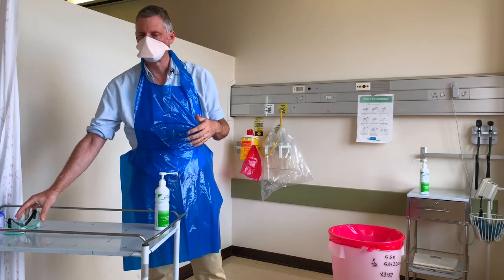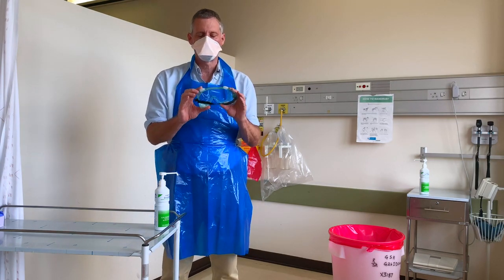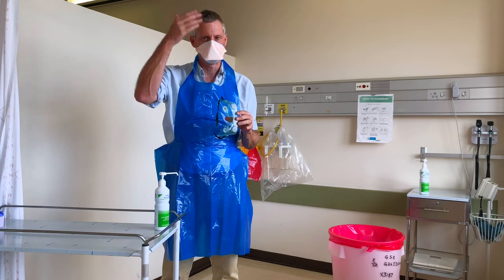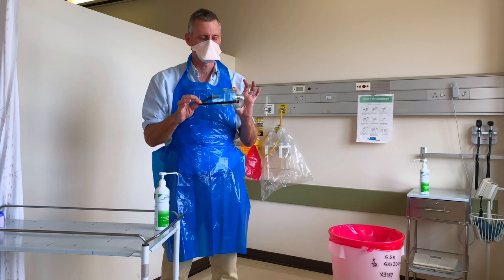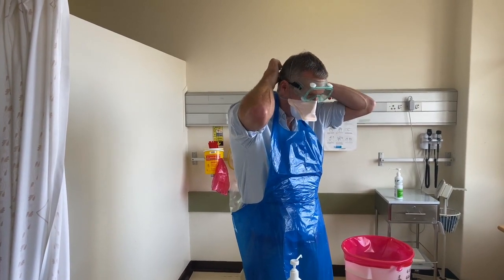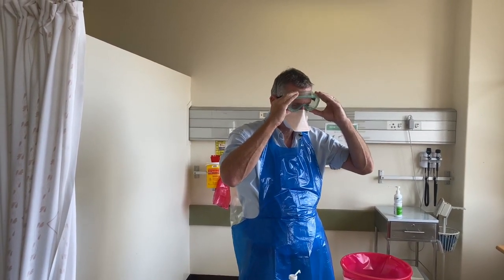Because I'm going to be doing an aerosol-generating procedure, I'm also going to be using face protection. I'm going to demonstrate the use of goggles. You may also use a full face visor if you don't have goggles — I'll come on to explain why that's important when taking it off. I'm going to make sure the goggles go onto my face with a good fit, ensuring there's no hair in the seal, that it's comfortable and fits well.